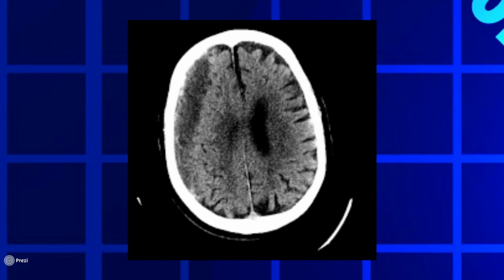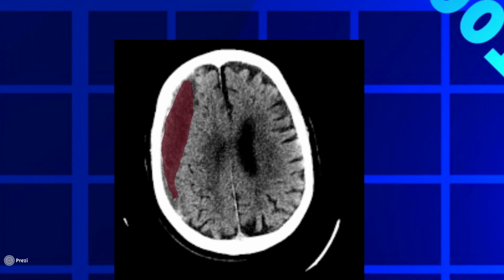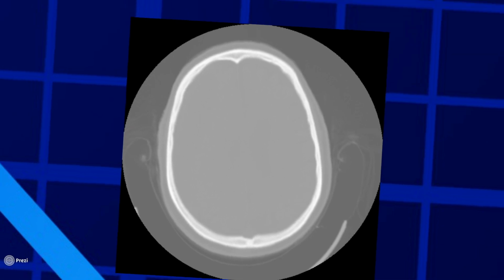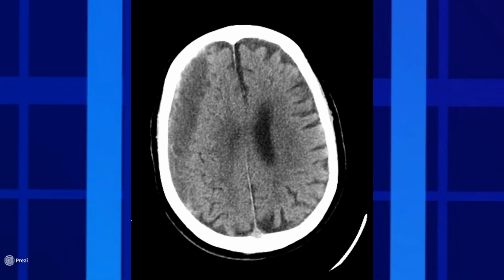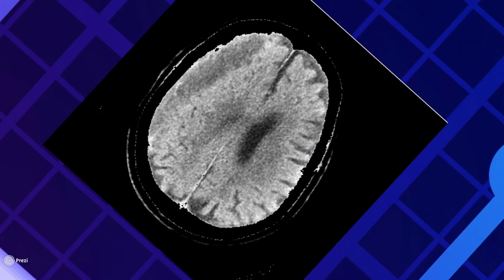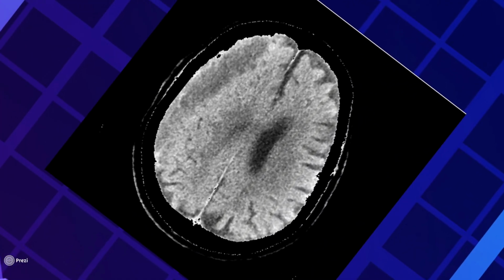In hematoma, there is a pooling of the blood towards the outer perimeter of the brain near the skull, such as in this image. Using image processing techniques, the way that we want this new system to work is that it would first adjust the contrast of the image to help make the different regions of the brain, such as the ventricles and the cerebral tissue, lighter or darker so that they are more distinct from each other. It would then recognize the part of the brain that was the skull and then crop that out, since we don't necessarily need the skull to find the hematoma region.